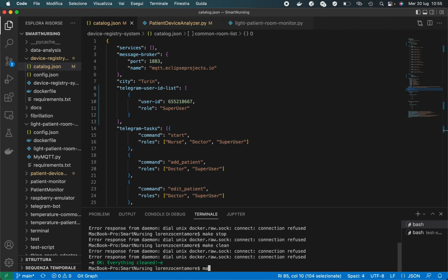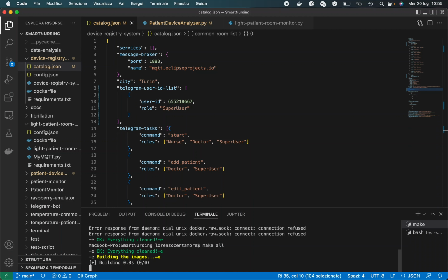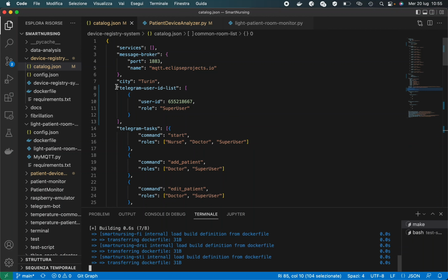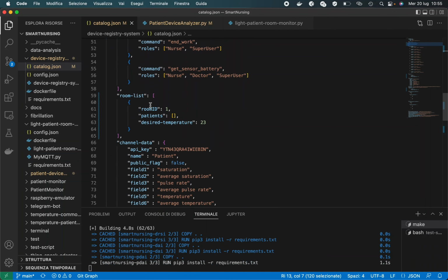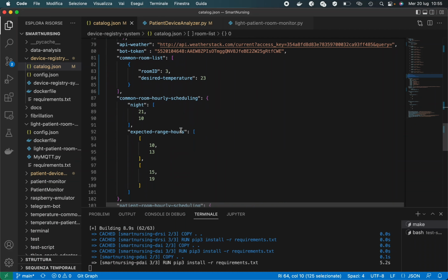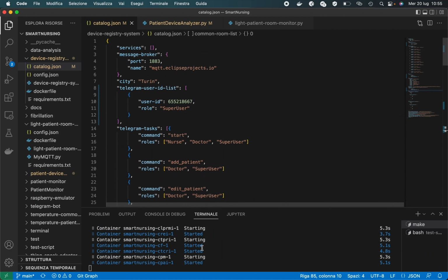In our implementation, since we emulate data, it will generate data for all the patients and rooms we have. Now I will run the system using a Make file to build the images, and through Docker Compose we will run them. Let's have a short look at the catalog. As we can see, we already have a user for Telegram. We also have a patient room and a common room with the desired temperature.